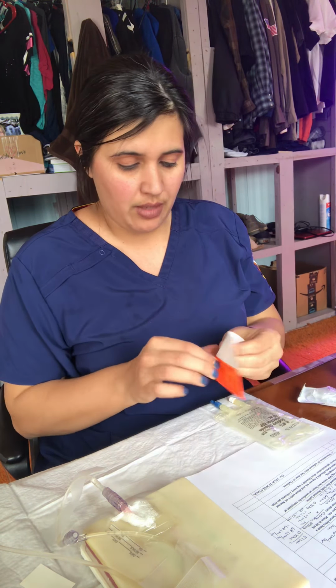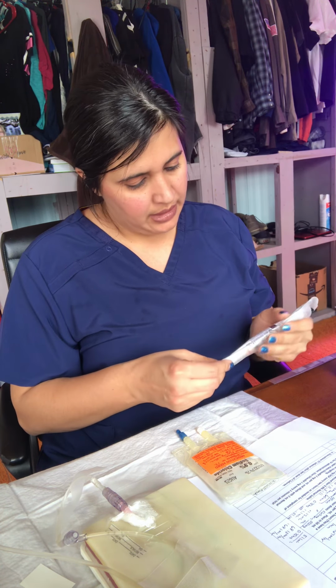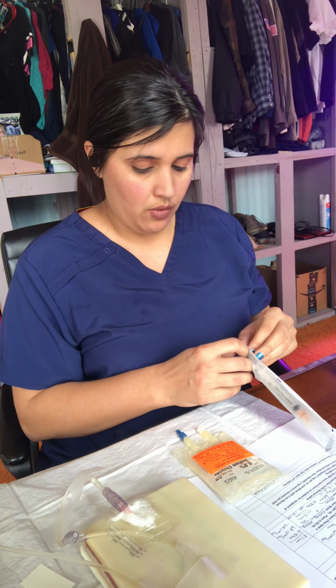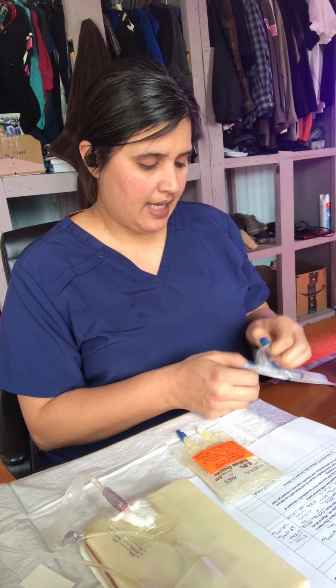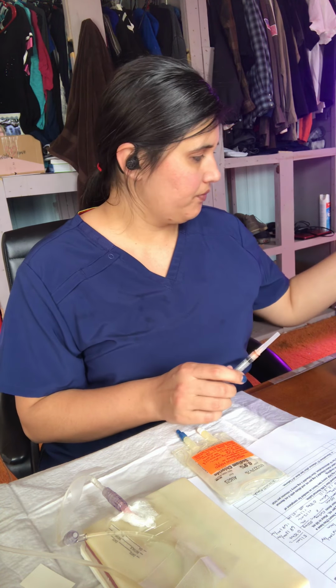Okay, so that's done. I am going to draw up the medication. I got myself a 3 milliliter syringe with a 25 gauge needle, and it's 5/8 inch long. So I will pull this out. I will take my alcohol pad and I will clean the top of my medication.